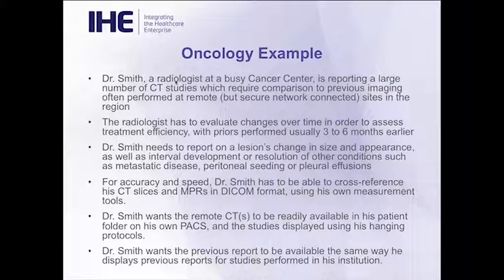The big frustration is to have to open a web interface where the images won't have the same quality, or you won't be able to compare the measurements because you don't use the same tools. And very often it's not the same environment, it's not the same vendor, and the radiologist is struggling, having to look at the images on their own PACS and compare with something which is very different.